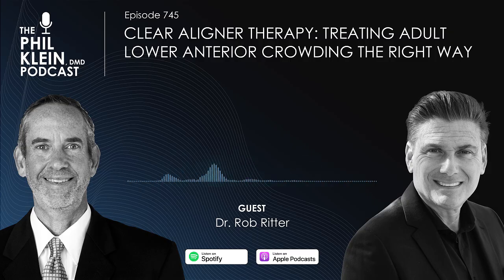It's not definitive, but it gives you an idea. So if you're questionable, you can send it out to the software and let them do a little bit of the work. If it's something that's simple, I'll do it. If I have to jump cases posteriorly with cross bites, massive rotations, overbites that are 100% deep, that's getting referred out.